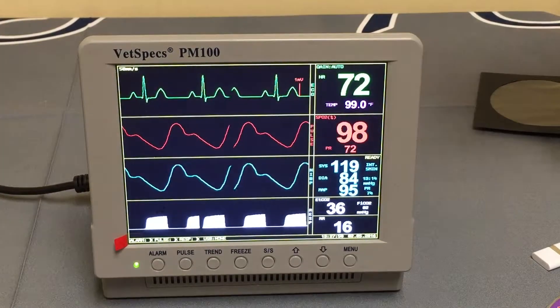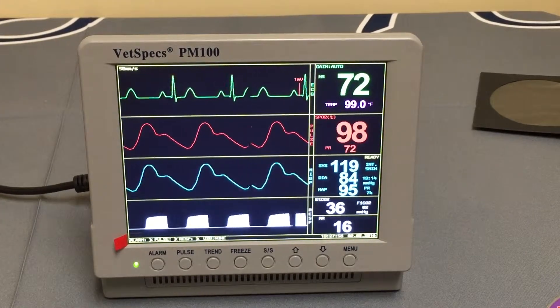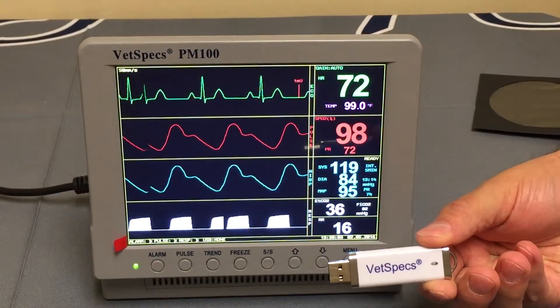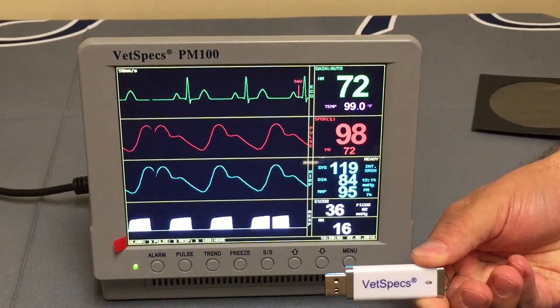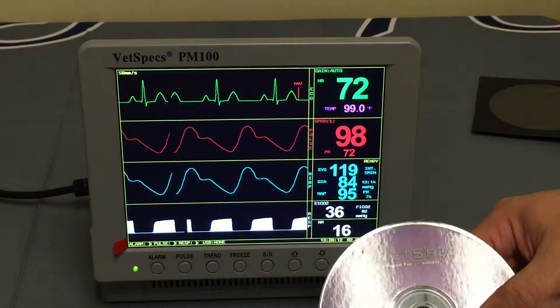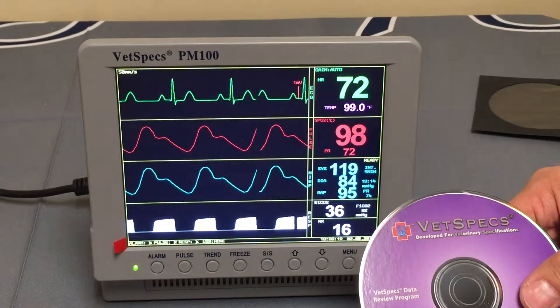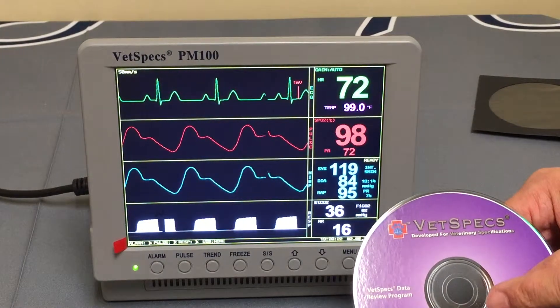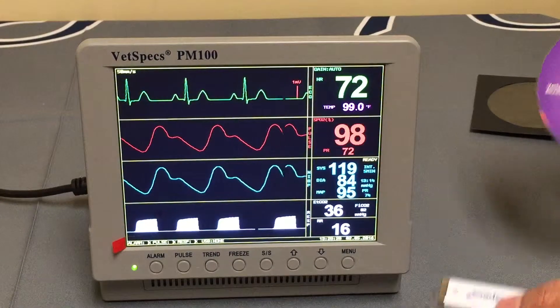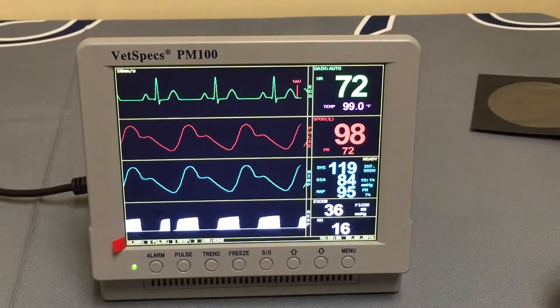VetSpecs has completely circumvented the thermal printout design and gone directly to USB flash drive saving. With the PM100 system, you receive a simple VetSpecs USB flash drive and a data viewing software CD. You'll load the software on your Windows-based PC so that it can view the saved files created by the surgical monitor. You'll need this software to view those files.